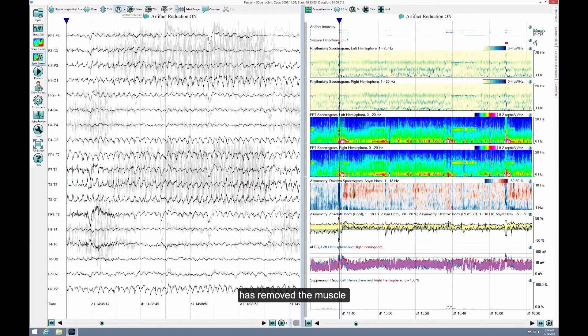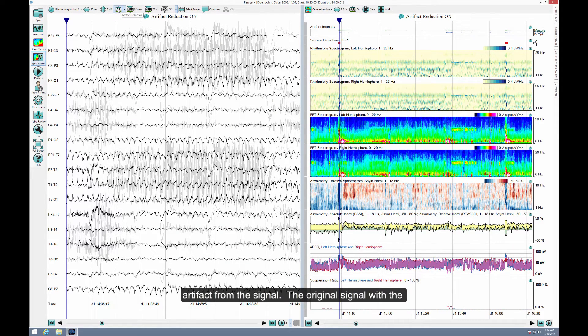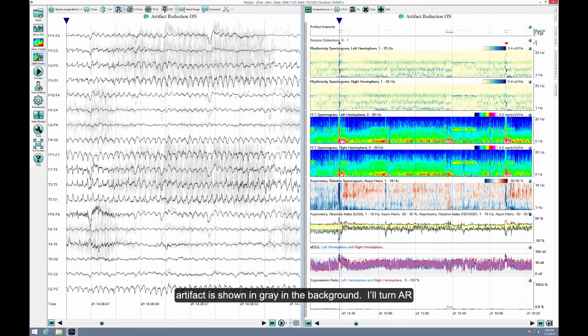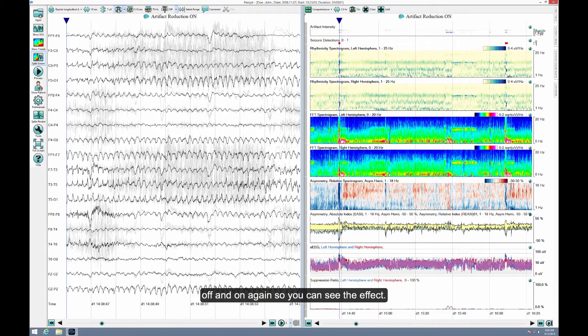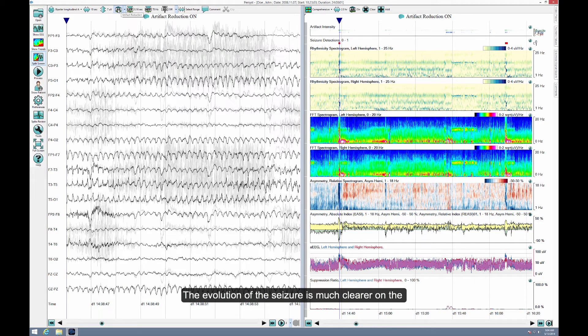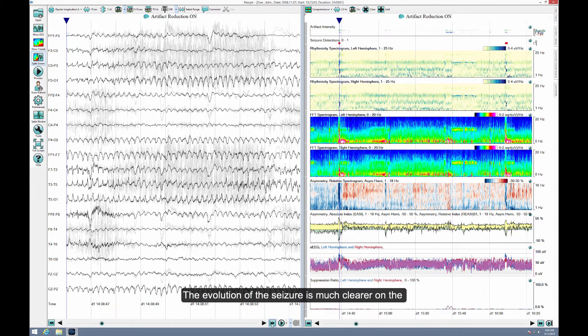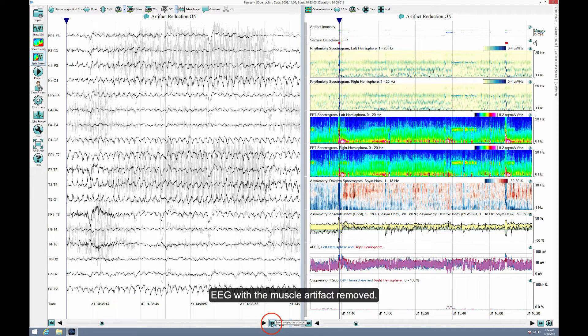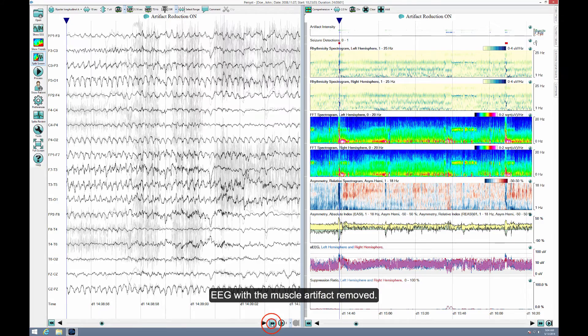Notice how AR has removed the muscle artifact from the signal. The original signal with the artifact is shown in gray in the background. I'll turn AR off and on again so you can see the effect. The evolution of the seizure is much clearer on the EEG with the muscle artifact removed.